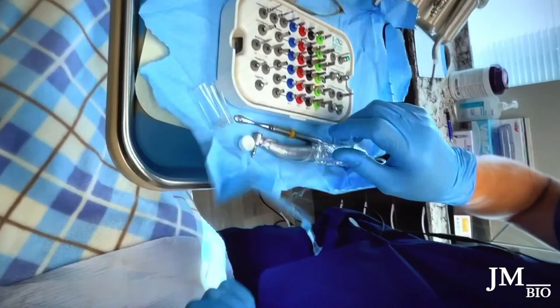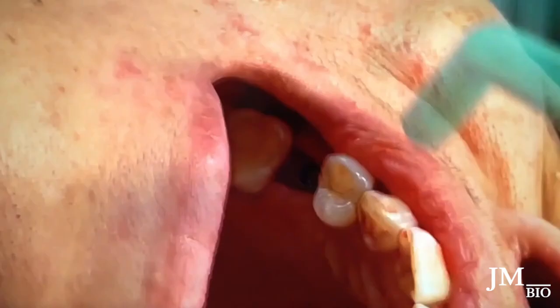I'm locking the implant into the driver. This is a 4x10 one-day implant. Make sure it's going in slow and just drive it all the way down. You can still change your angulation as you're placing, so I'm constantly looking, checking that I'm happy with the positioning, placement, and angulation overall.